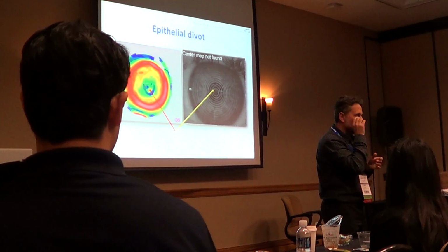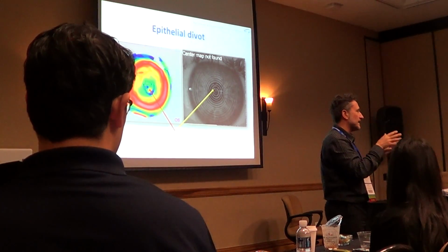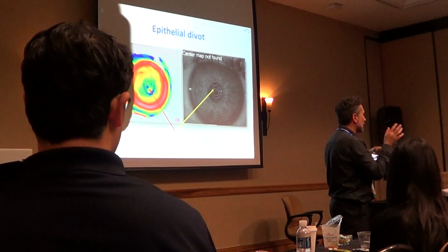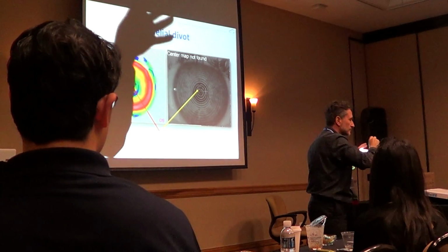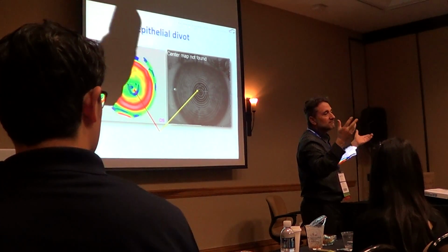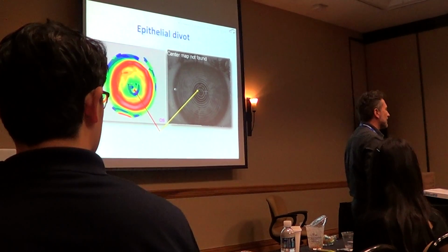Then I have a quick look. After 3 minutes, I decide if this lens is right or not. I replace the lens or not. If I replace the lens, it's another one from the trial set, 1 step or 2 steps and so on. And after that, I do the over-refraction, and after that, yes, I order the final lens.